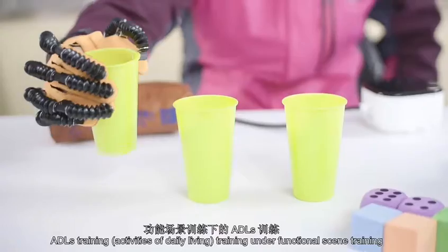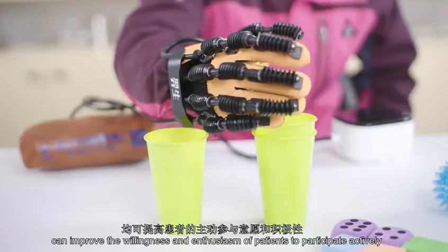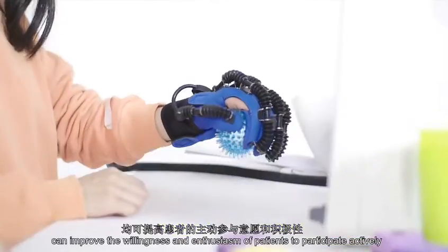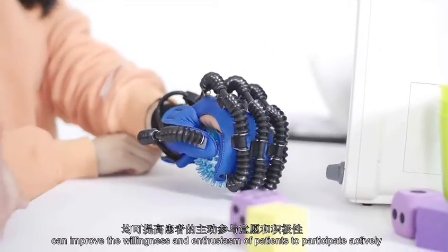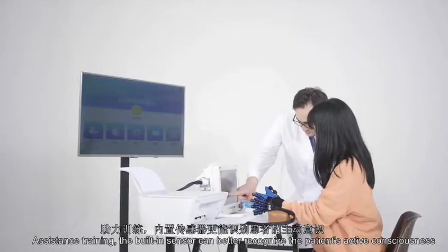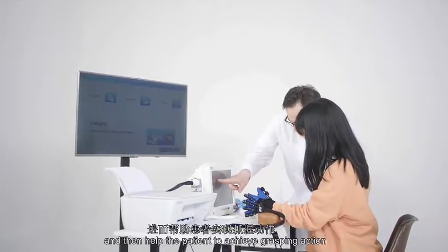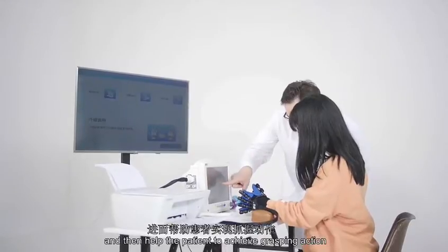ADL Training — Activities of Daily Living training under Functional Scene Training — can improve the willingness and enthusiasm of patients to participate actively. With assistance training, the built-in sensor can better recognize the patient's active consciousness and then help the patient to achieve grasping action.